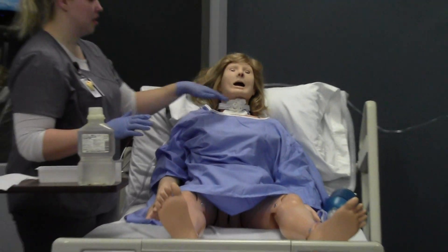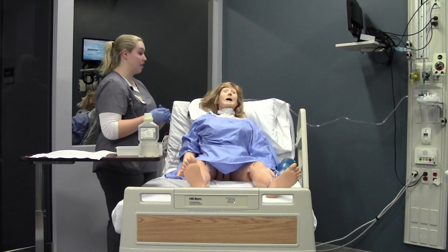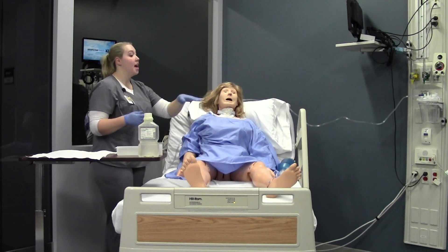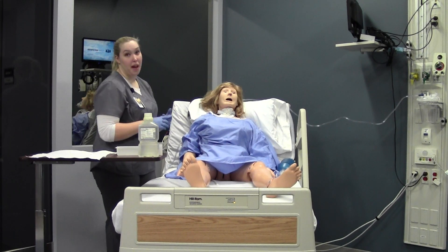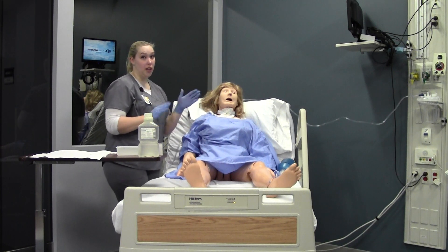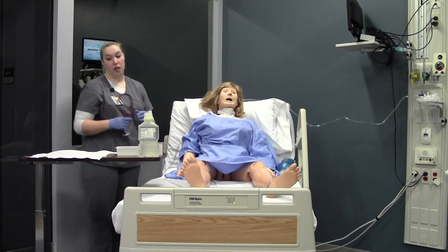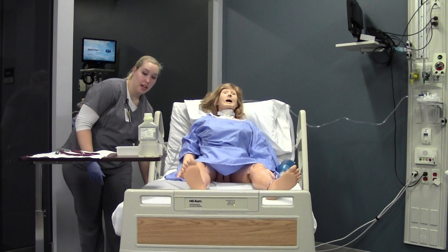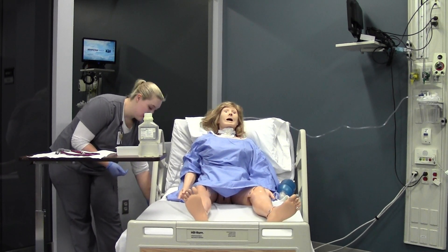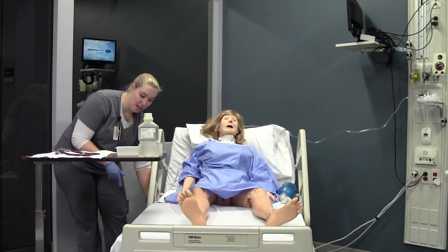Now I'm completely done. I need to listen to my patient's lungs again to make sure any adventitious lung sounds have cleared. If not, I would do a further respiratory assessment and let the physician know. Clean up all supplies — move suction tubing back to the canister, put the Ambu bag back by the oxygen source. Tuck the patient back in, take any linen savers and extra trash, make sure oxygen sats remain the same or at least above 90%. Put their bed rail back up, lower the bed to the floor, and take all supplies with you. When done, go back to the chart and document what you suctioned out, what it smelled like, skin cares around the stoma, and any drainage noted.